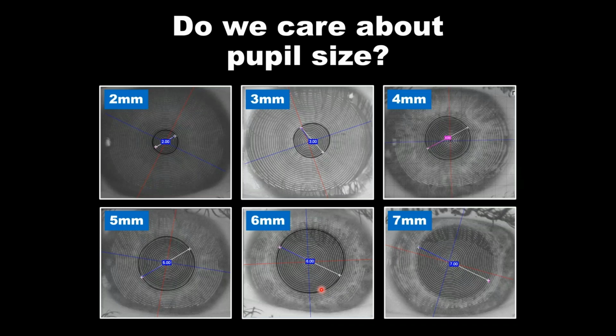Now, pupil size is another important value that I think we overlook, kind of like the visible iris diameter. When are we dealing with the incredibly small pupil? If we're trying to fit a multifocal contact lens that has its power at 3 or 4 millimeters, how are we going to provide that patient with multifocality when their pupil may only be 2 mils?